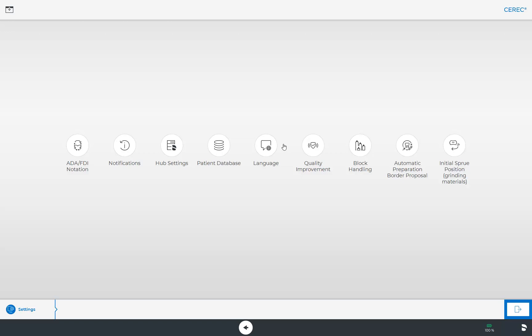When using the CEREC software, notifications can be displayed either via tooltips or pop-up windows. You can turn these off under Notifications or reset them if needed.